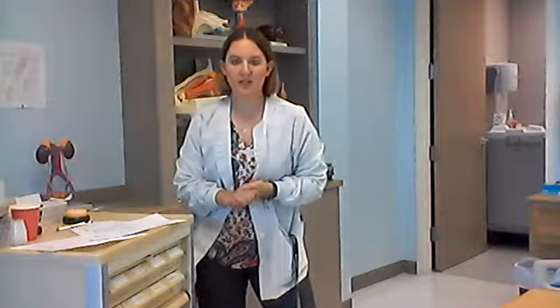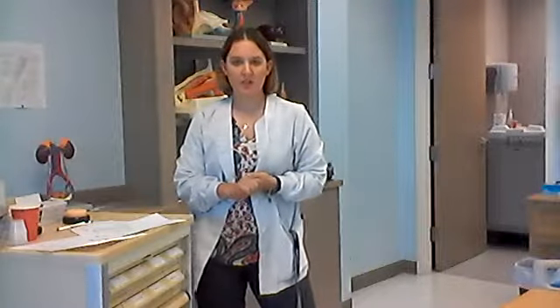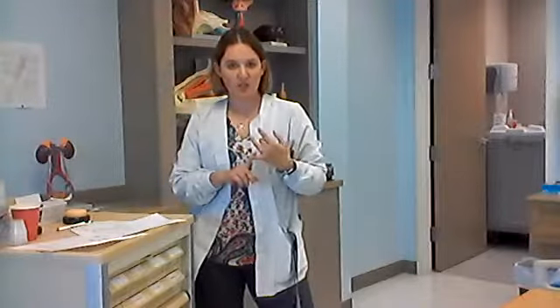Liz Green's here with Stotzenberger College of Practical Nursing. This video is to demonstrate the injection checkoff. In the checkoff, you will be doing an intradermal injection, a subcutaneous injection, and an intramuscular injection.